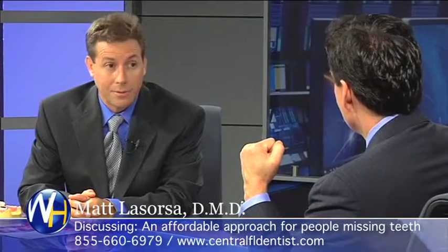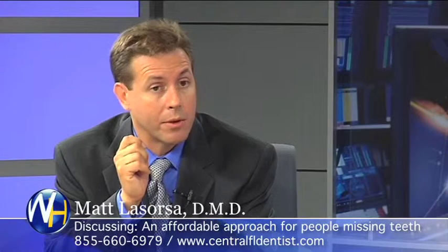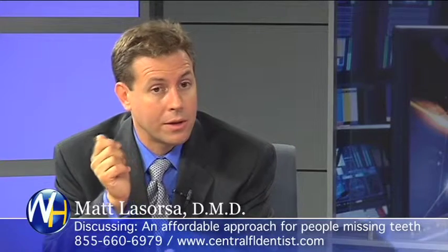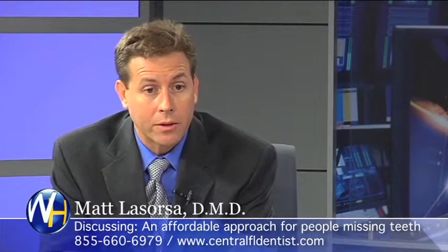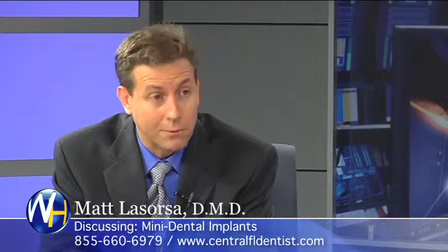Yes, we put 4 mini implants on the lower, and we have the housings built into the denture, and then they are secured onto the implant. So she can take them on and off. And these are made to wear most of the time. You don't have to take them out at night. You're supposed to actually leave them in. So she can wear them at night. Yes. That's nice. So she doesn't have to worry about being without her denture or leaving them somewhere. They just take them out once a day to clean them and put them right back in.